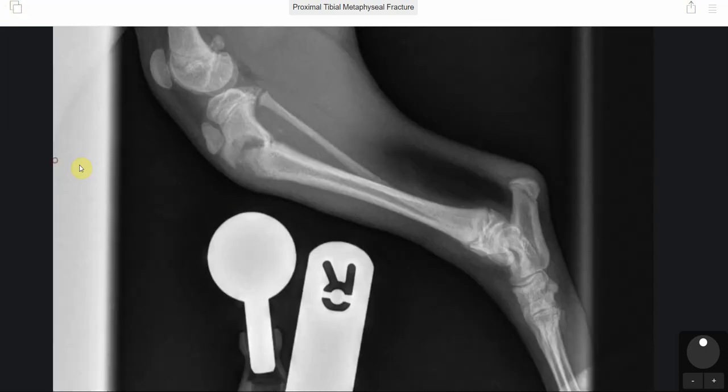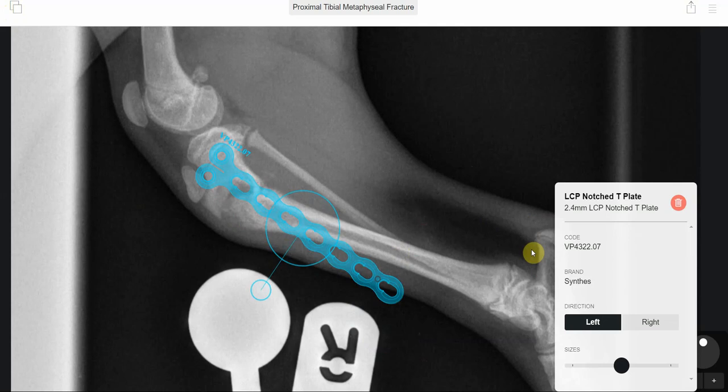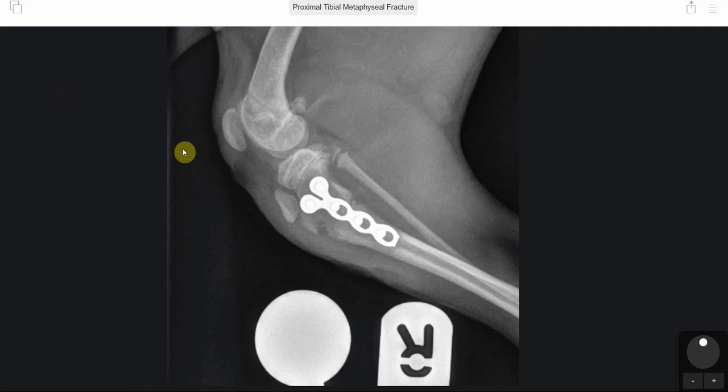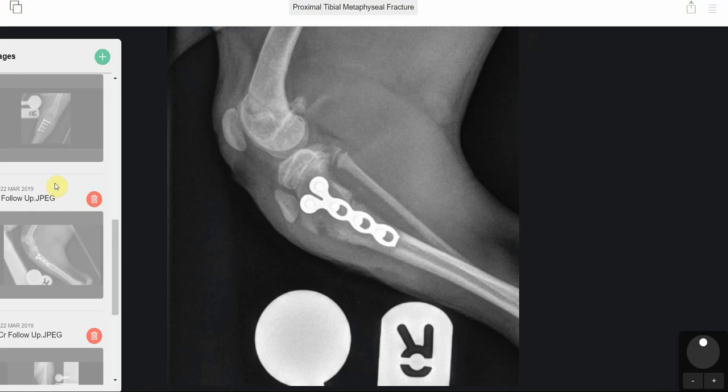These are unusual fractures to see — these curved proximal tibial metaphyseal fractures. But the good thing is that we came up with a good plan, which was to use the notch T plate. That notch T plate, the Mickey Mouse plate, gave really good long-term function for Stone.